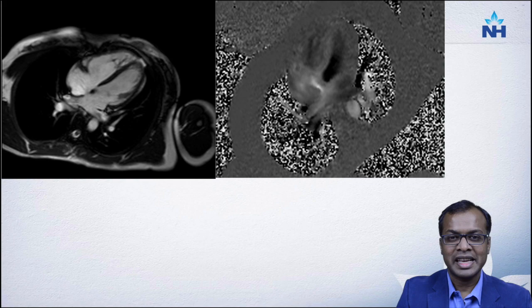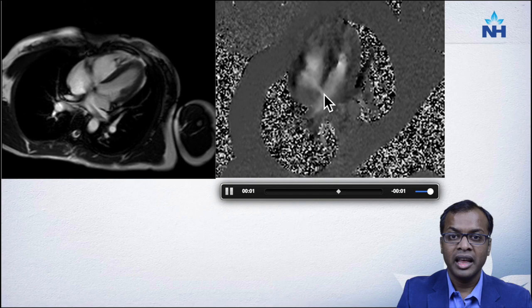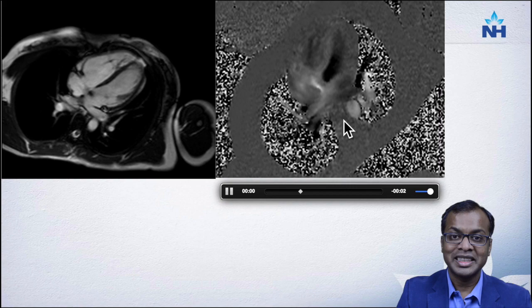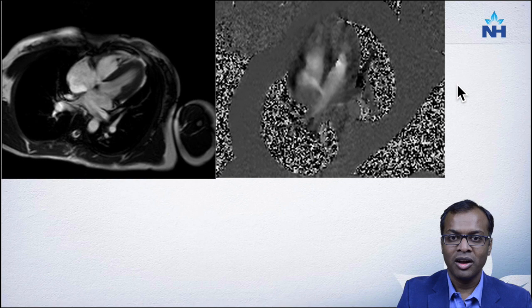MRI is extremely useful in assessing shunt lesions. In this case you can see a nice shunt from the left side to the right side at the level of the ASD, which helps not only in quantifying the shunt but also telling us which direction the shunt is going. It is fantastic in assessing the QP/QS ratio and helps determine the etiology of pulmonary hypertension.